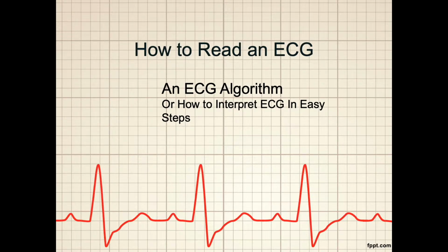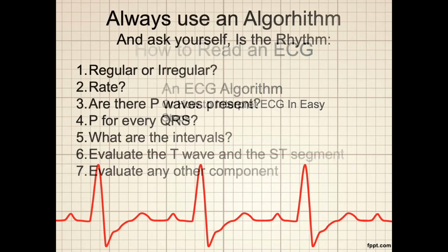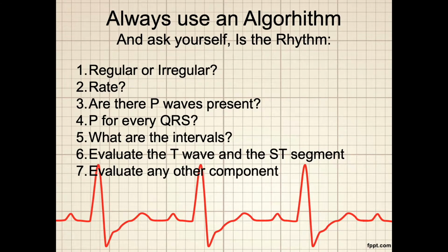No matter which algorithm you decide to use, always use that algorithm. In other words, don't cut steps out. It's when you try to take shortcuts that you will end up making a mistake.